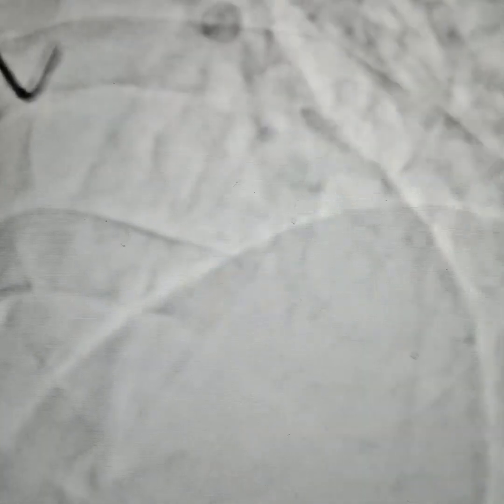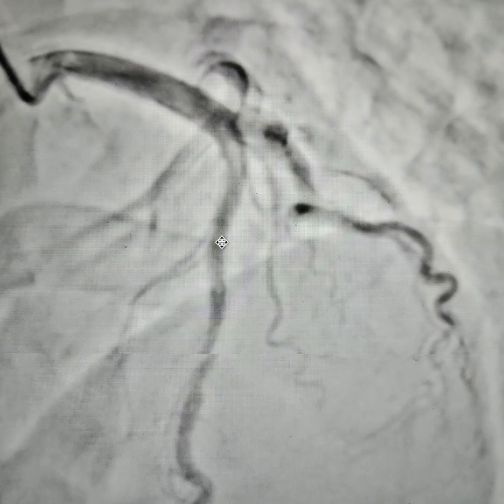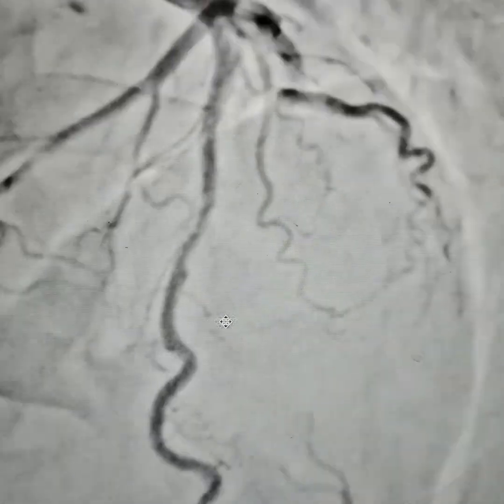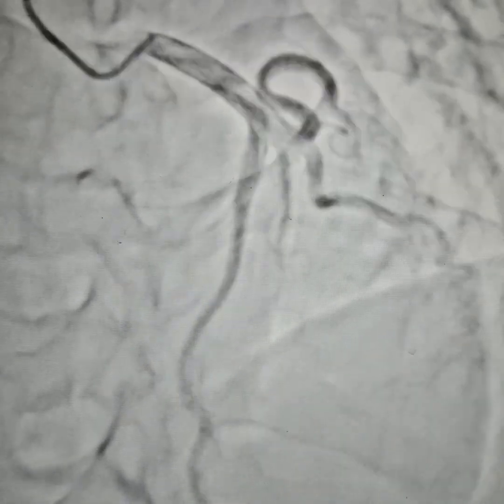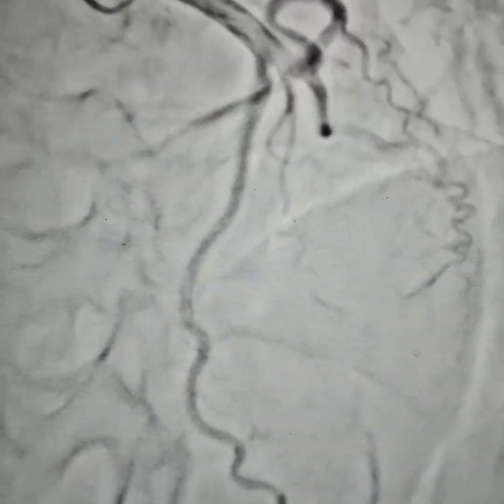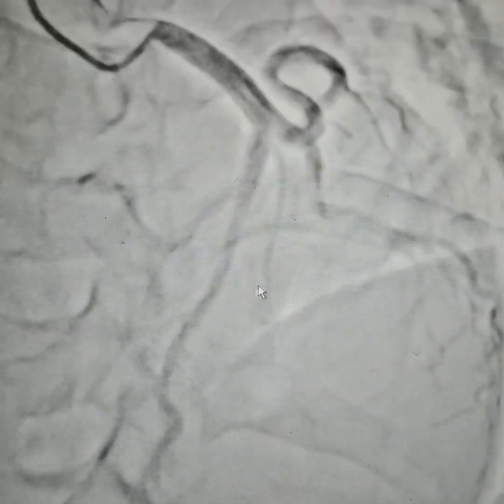So this is a myocardial bridge. You can see it here very clearly. Moving on to the next view, you can see about 40–50% compression.